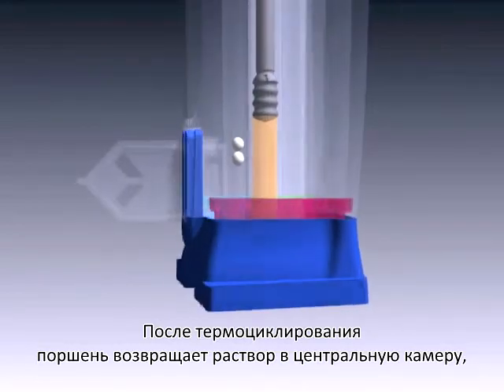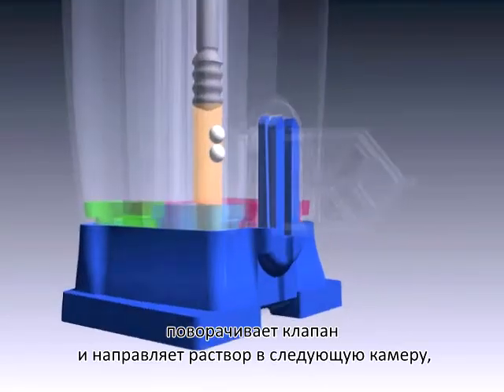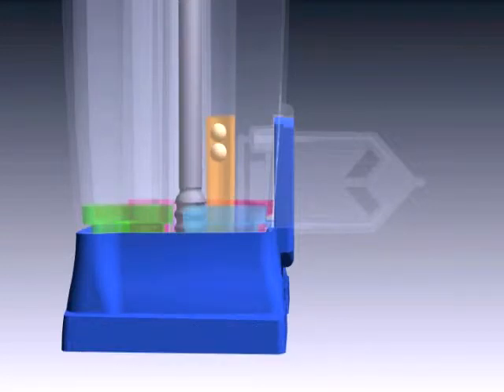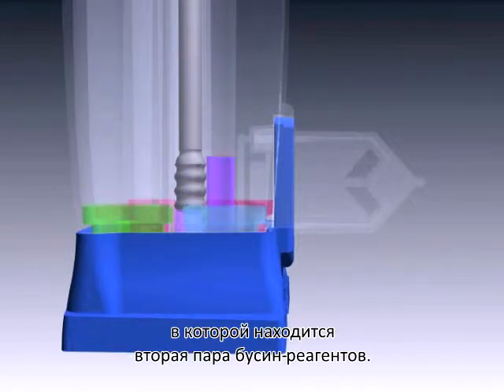the plunger returns the solution into the central tube, rotates the valve body, and pumps the solution into another chamber where a second set of two reaction beads are dissolved.